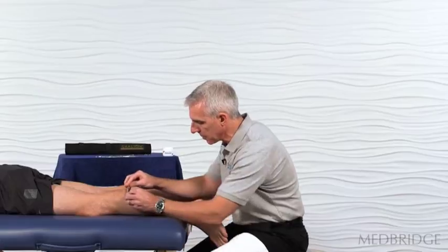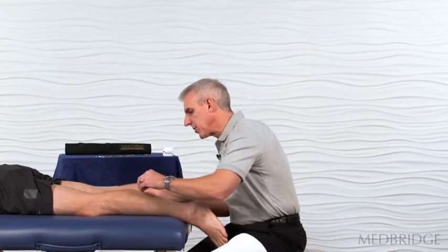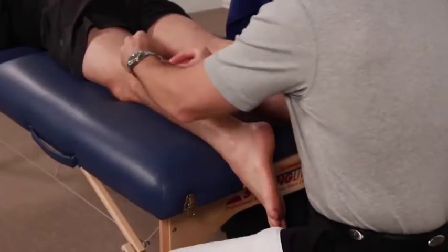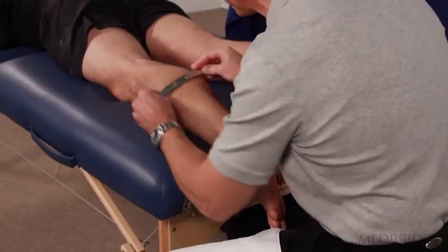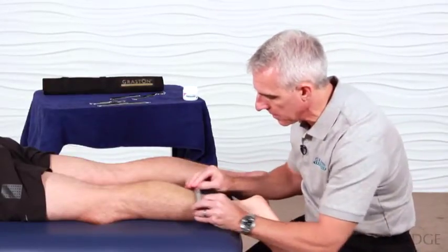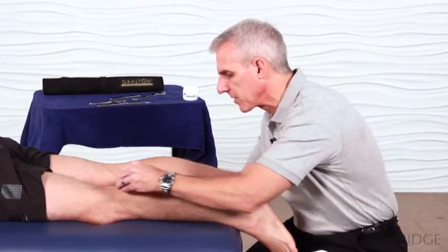We're going to start very superficial. We've already assessed the tissue and identified the restrictions, so now we're just trying to improve mobility of the tissue with the instrument. We're starting in a static, unloaded position. We start fairly light and gradually increase our aggressiveness.